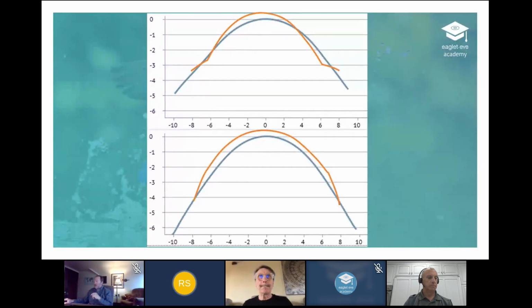So we needed a lens having toricity in the limbal zone. And that was at the point where Jason Jetlika came up with, yeah, I just designed a new lens. It's called the BT, or nowadays bi-elevation. And in that lens, we keep the optical zone spheric, but all other parts, all other sections are toric. So that's what we've done.